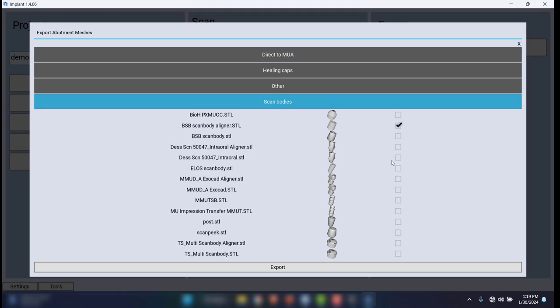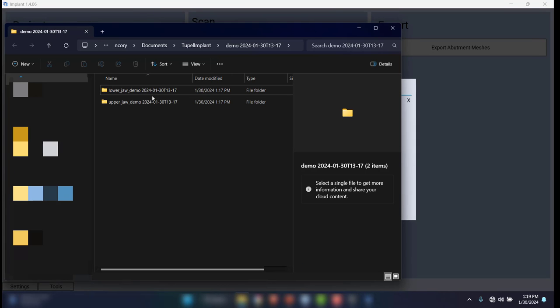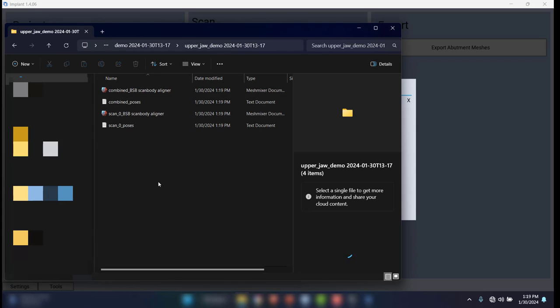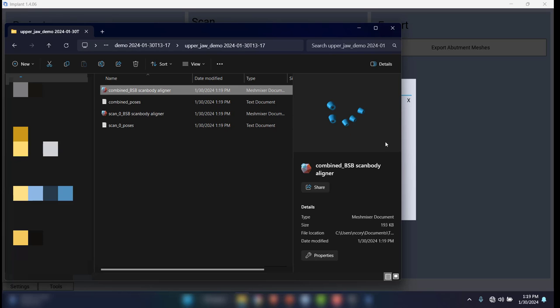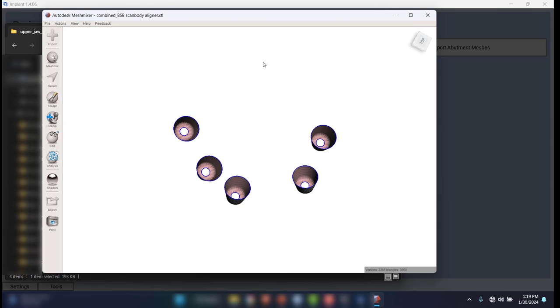If at a later date you find you need some other piece of data, the lab needs it, whatever, you can just reopen this and export them at that point, as long as you saved your case. All right, so I'm going to export, and here they are. It's created a folder for upper and lower jaw. Here's my upper jaw, and if I was to open these scan bodies in a random program like MeshMixer, here they are. Okay.